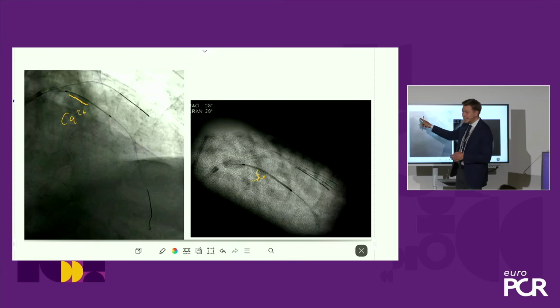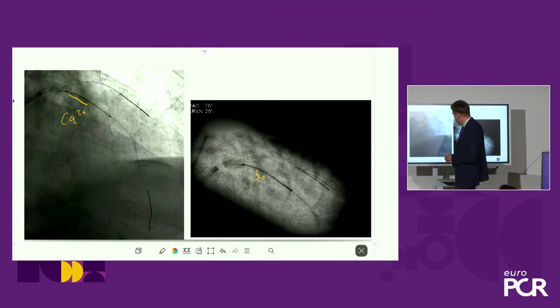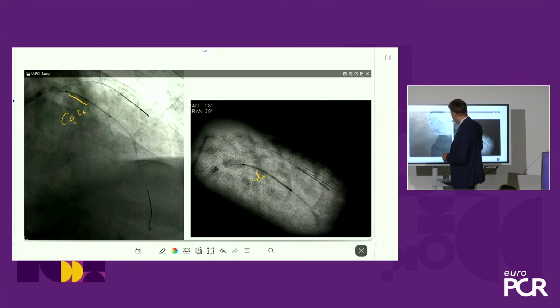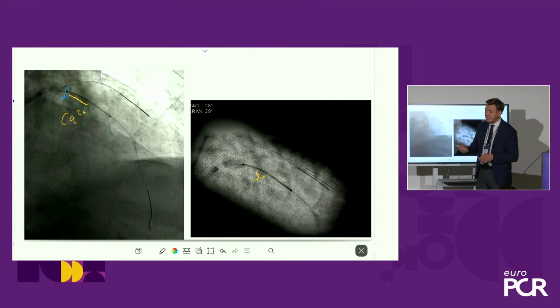You use the existing knowledge from the co-registration and IVUS, you have that in your mind as the planning, and for the instantaneous guidance, you rely on the stent enhancement that shows you calcium, and then you know that with your stent, you are going to be above that, and that you have to land here, just above the calcium. That, I think, was an important point for me. So you had instantaneous guidance as well.